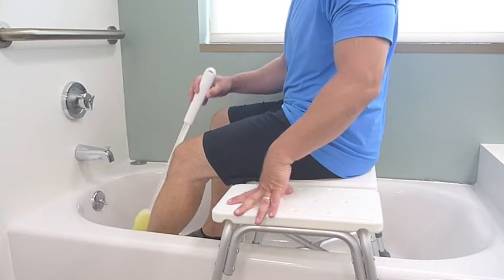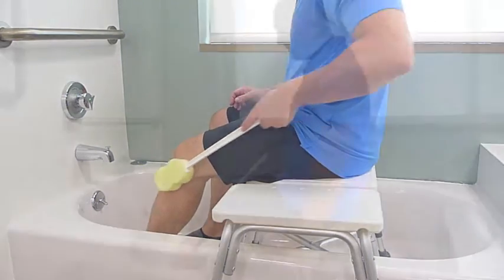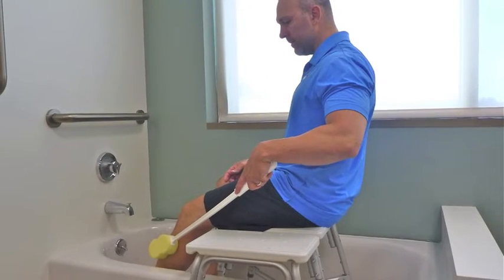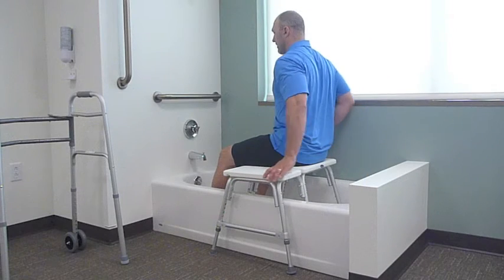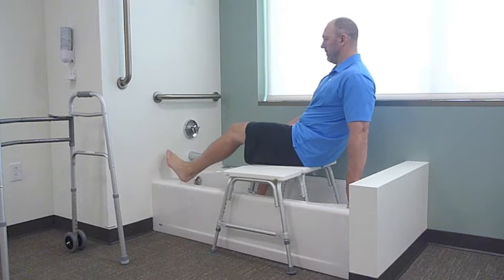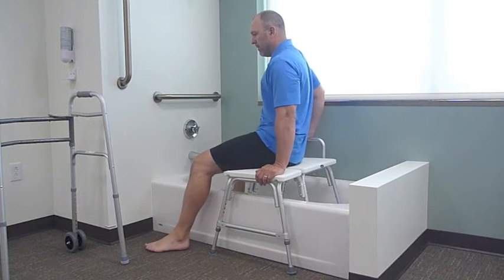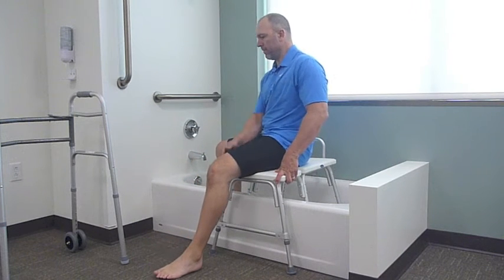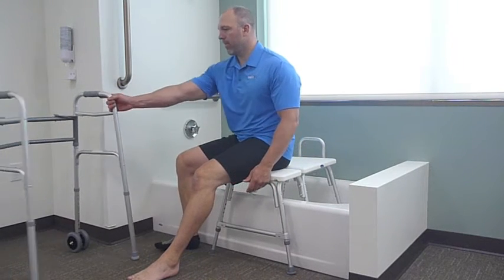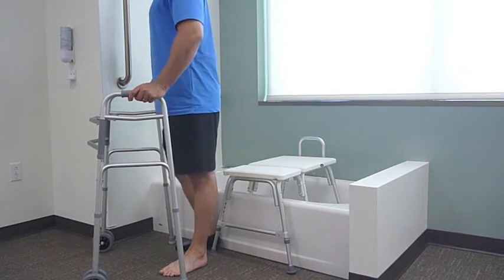Use the long-handled sponge to wash below the knee, keeping your knee and hip in good position. When done, lean back, supporting yourself with your arm, and help lift the injured leg out of the tub. Once again, scoot over to the edge of the bench, adjusting as needed, and then lift the uninjured leg over. Stand using good form and strengthen your uninjured leg.